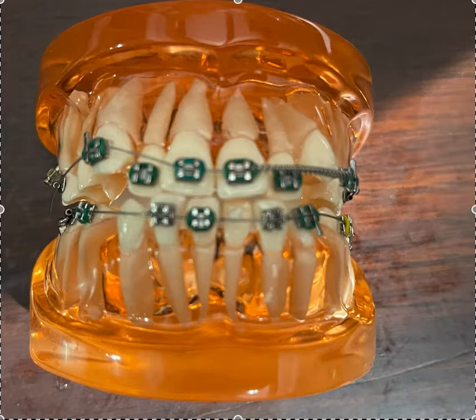The main thing you need to know is that you need to pick one, stay with one, and that's the bracket you use. So if patients transfer in from another provider, that's the first thing you're going to ask: is this 022 or is this 018, and what is the prescription? Unless it matches the bracket that you're using. Now, you can have an 022 Roth from one vendor, an 022 Roth from Ormco, and one from 3M, and you should be able to mix and match. If a patient's bracket breaks and they lost it, you can use one of yours, even though it might be from a different vendor, and it should perform the same way. I don't know if that makes sense.